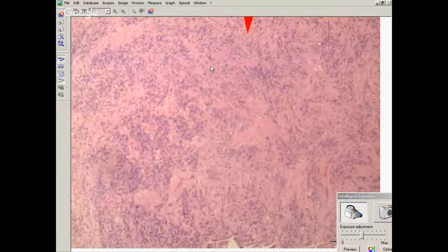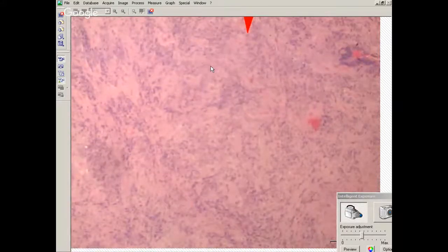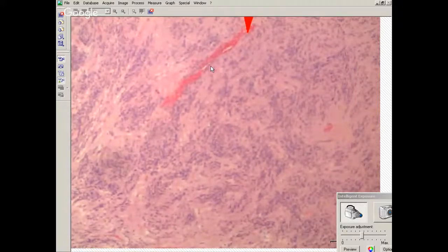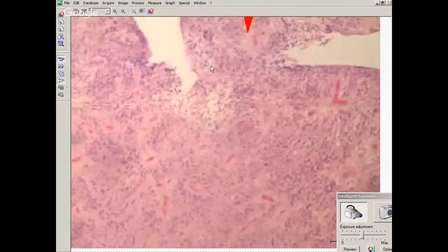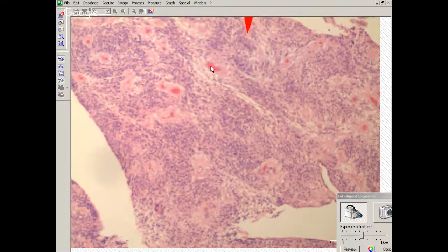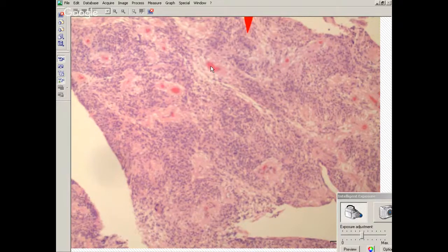Myxopapillary ependymomas can look like garden variety ependymomas, but you can have what's called a tanycytic ependymoma where it looks like just fibrillary cells. Glial cells, they are glial cells. And so if you do a biopsy through an area of a tanycytic ependymoma that doesn't have this perivascular rosetting, perivascular pseudo-rosetting, then you might be confused with an astrocytoma.